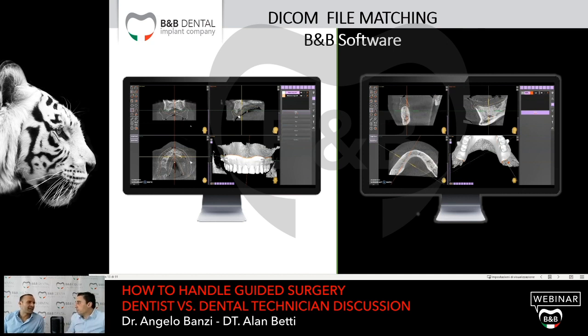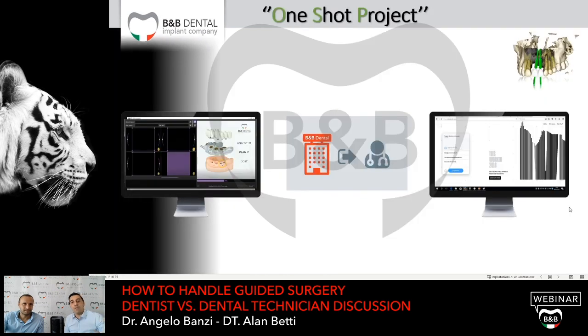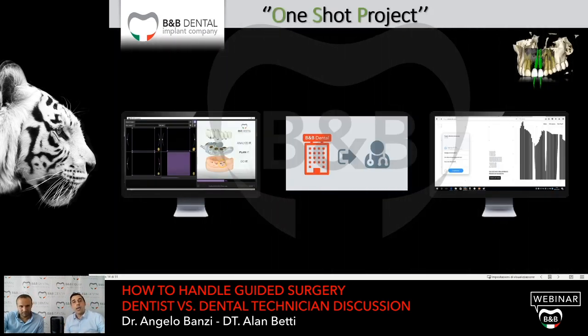It's a CAD/CAM software. The CAD is the software, and the CAM is the milling machine part. You can manage everything: the importation of DICOM files, matching, importation of STL files.